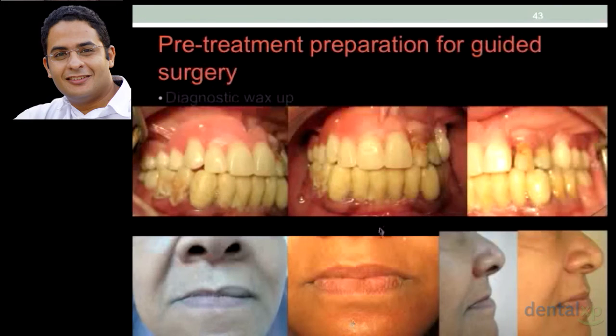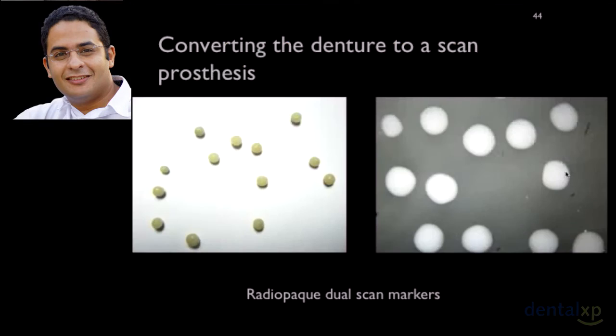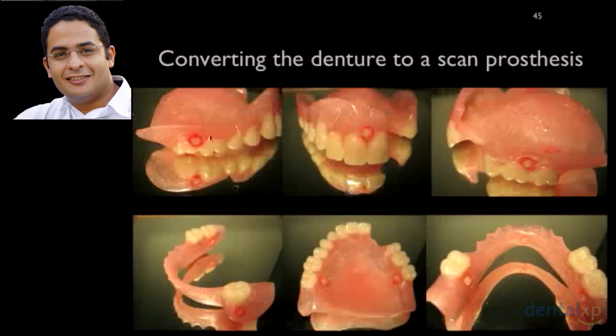Okay, so we start with the pre-treatment preparations for guided surgery. Here we do our diagnostic wax up. We check the position of teeth. Here we see the difference in support of the soft tissue before the wax up and after the wax up. And then we convert this waxed up denture to a scan prosthesis. As you see in this picture, we have these balls, what we call scan markers, and here is the radiograph showing that they are radiopaque, and we insert them in certain areas in the upper and lower denture.